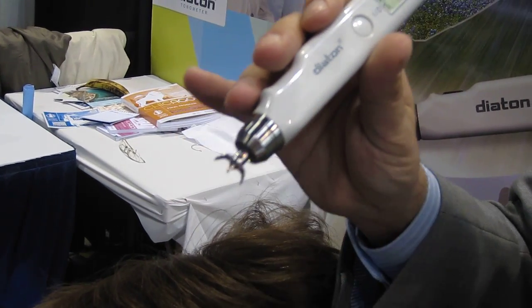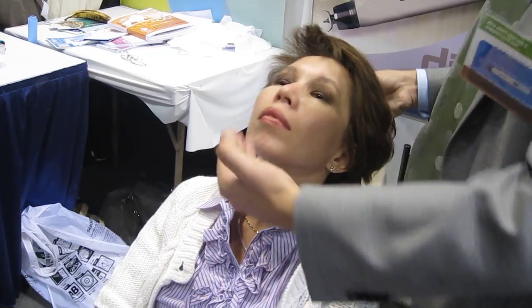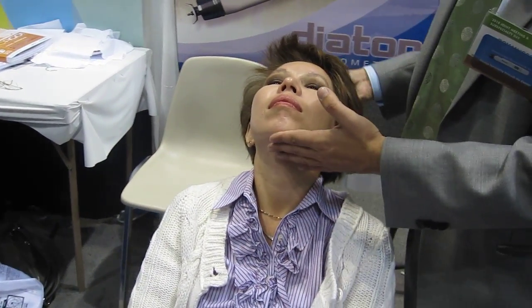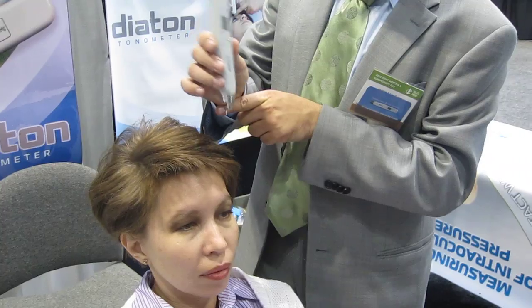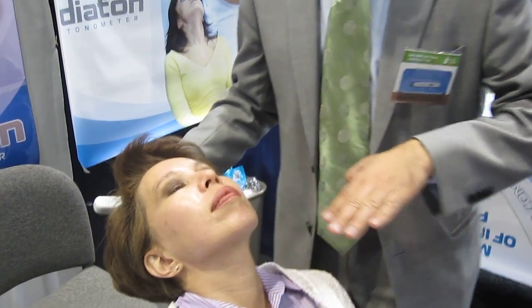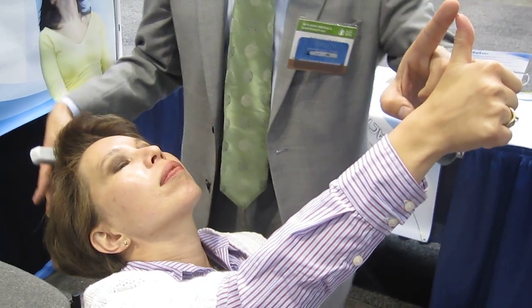For the second eye, the patient is already positioned properly. If you are right-handed, you are on the left-hand side of the patient, because you want to make sure you are using the edge of your palm on the patient's forehead for stability. Make sure the head is as horizontal as possible.